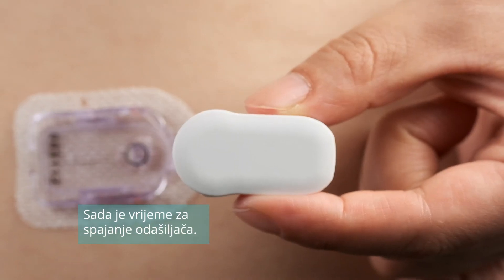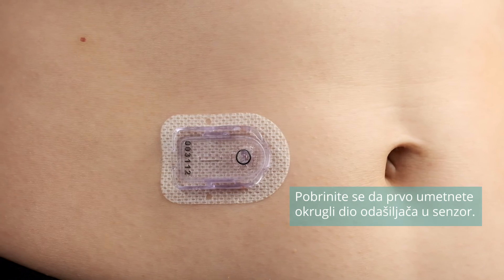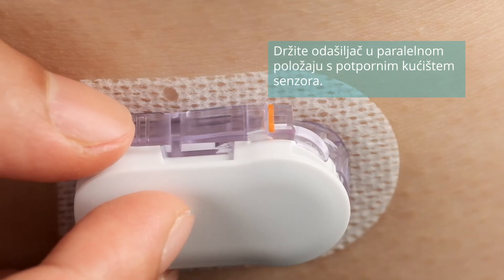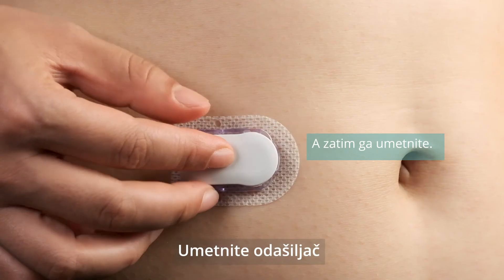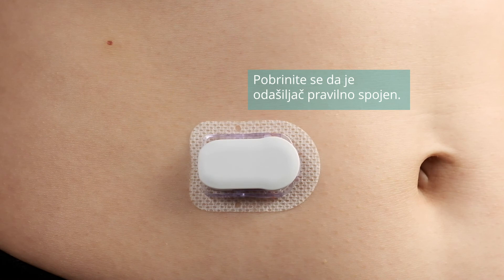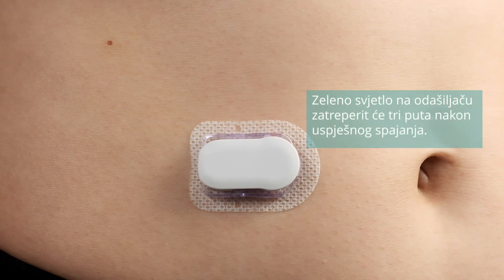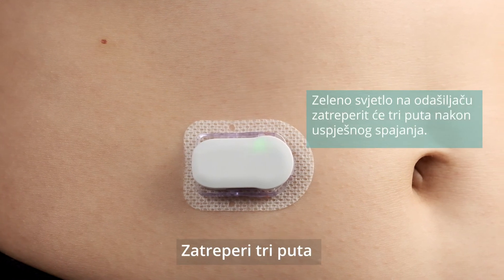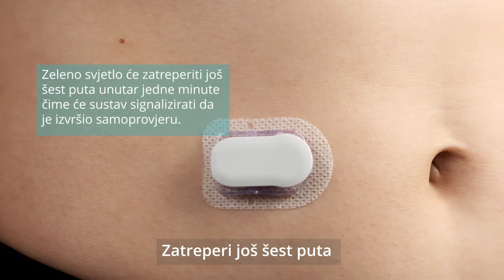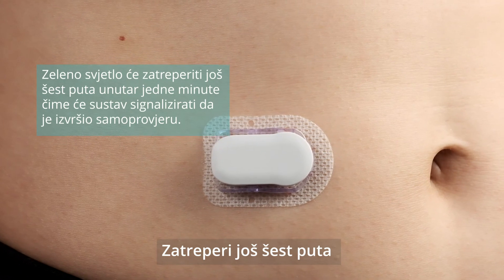Now it's time to attach the transmitter. Make sure you fit the round part of the transmitter into the sensor first. Keep the transmitter parallel to the sensor support mount, then snap it in. Make sure the transmitter is securely connected. The green indicator light on the transmitter will flash three times after successful connection. It will flash another six times within one minute, indicating the system check has finished.